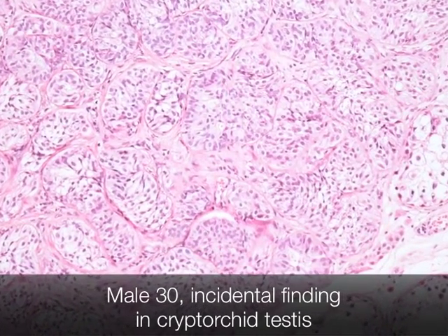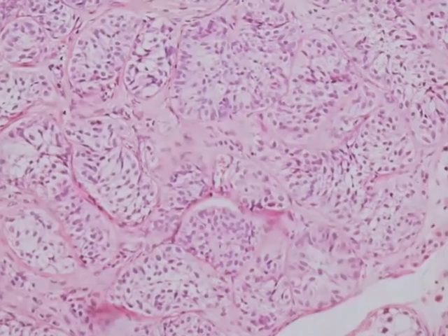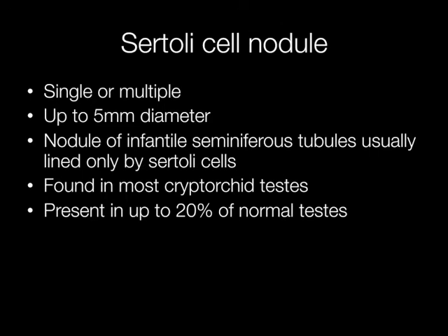This is a Sertoli cell nodule. These are extremely common — they may be present in up to 20% of normal testes but are most frequently seen in cryptorchid testes. They may be single or multiple and up to around five millimetres in diameter. Histologically they are composed of infantile type seminiferous tubules usually lined only by Sertoli cells.